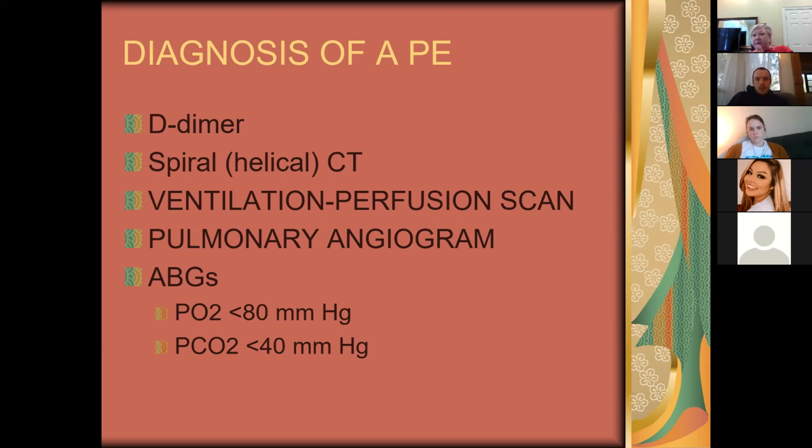If you have a hospital that has it, they can run a helical CT, a spiral CT. Not all hospitals have a spiral CT. It costs a lot of money. I have to tell you, and they may have it now. This was several years ago, but they also run spiral CTs for kidney stones.